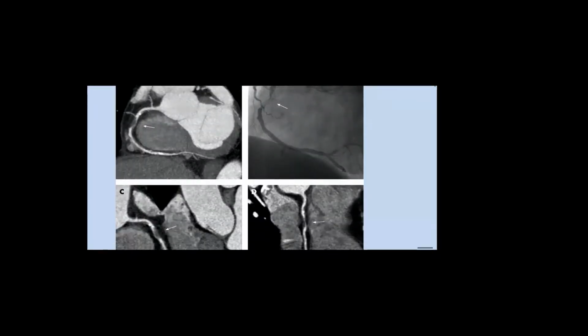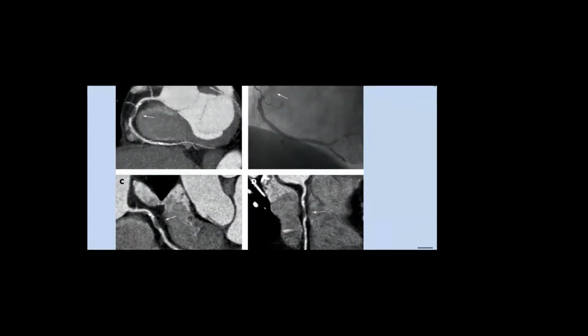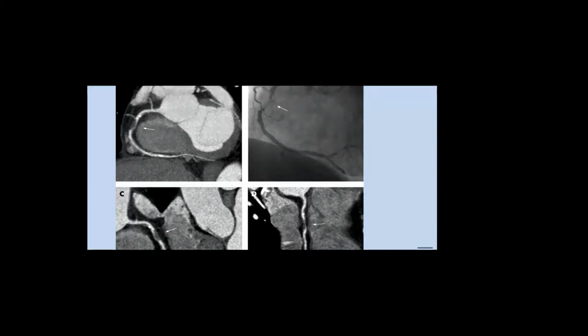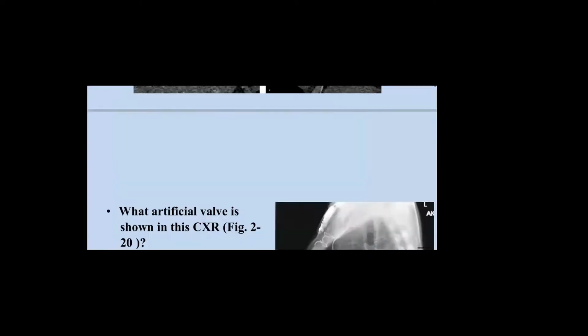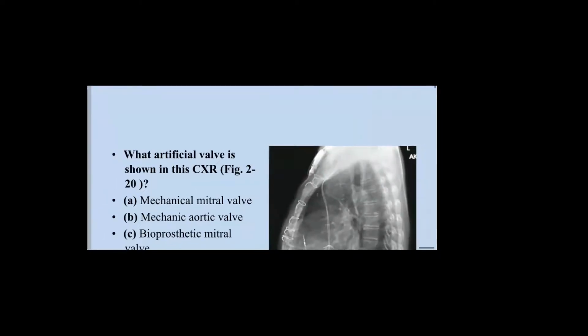Okay. Now, what do you see here? That's an RCA. And see, the RCA is seen in different orientations, so you won't be fooled by an eccentric lesion or stuff like that. When you navigate the data by different display modes, you will be accurate in your quantification. And you see the corresponding coronary angio has showed the same high-grade atheroma, stenosis.